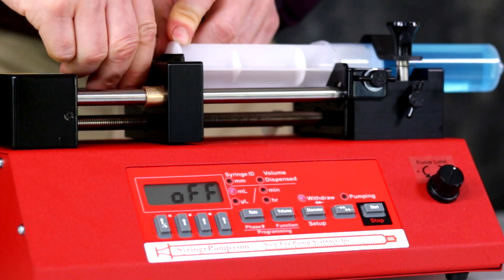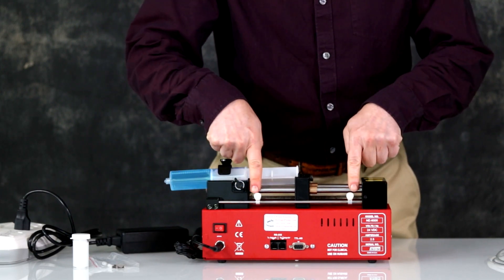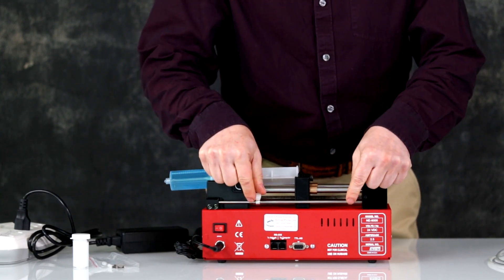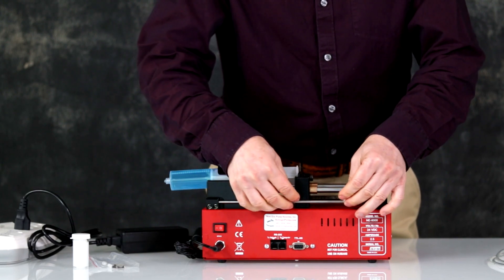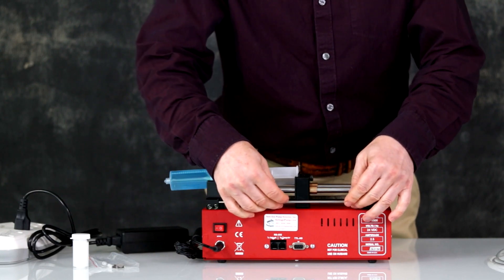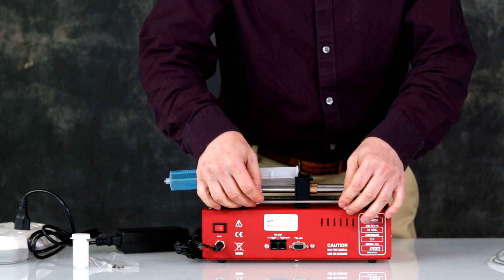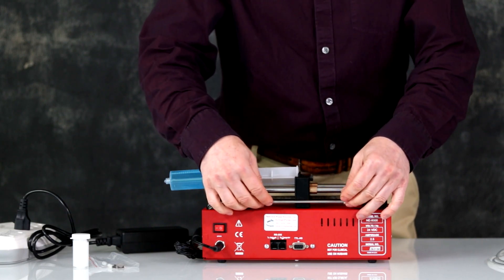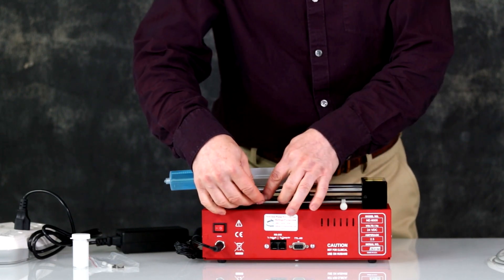NE-8000 setting limit switches. At the rear of the pump are the limit switches. Turn the screws to loosen for adjustment. Limit switches limit the travel of the pump and can be used in programs to stop the pump at certain points while changing directions. Position them and tighten into place.